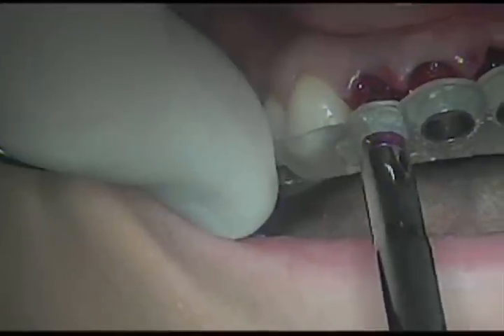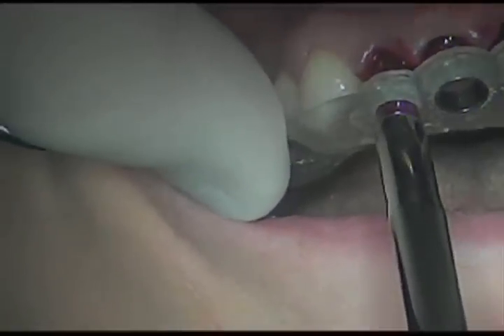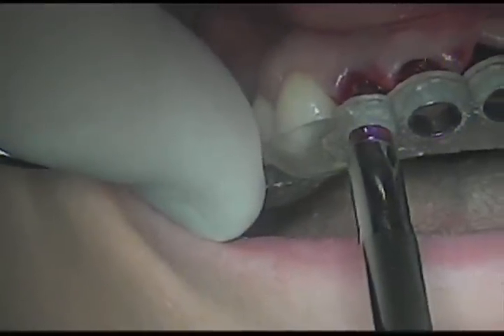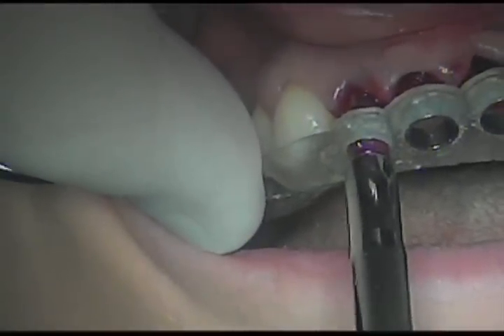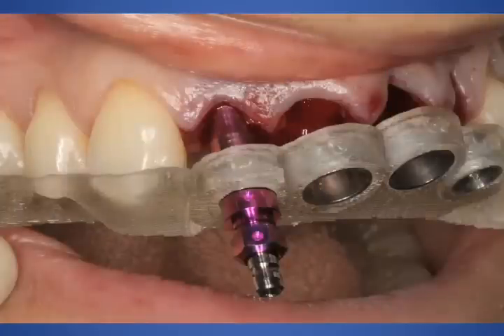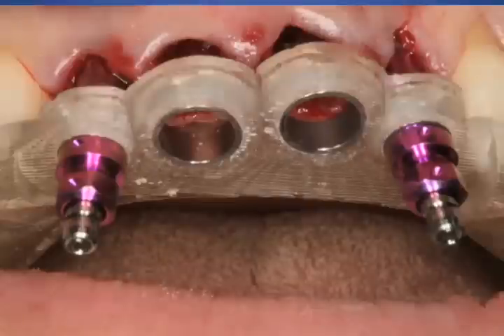You can see the little markings, the little dots in the Replace system. We want one of those dots to be towards the facial. That's where one of the lobes is facing towards the facial, which will allow us better final abutment creation and better aesthetics in the long run. So that little dot is facing towards the facial. And here's a close-up view of that. You can see we went all the way to the top. Very precise, very exact, very difficult to make an error in this situation.